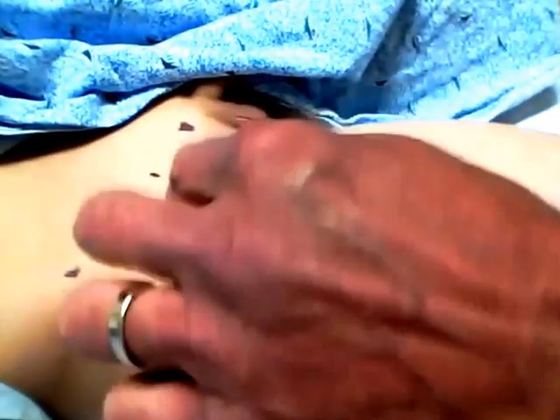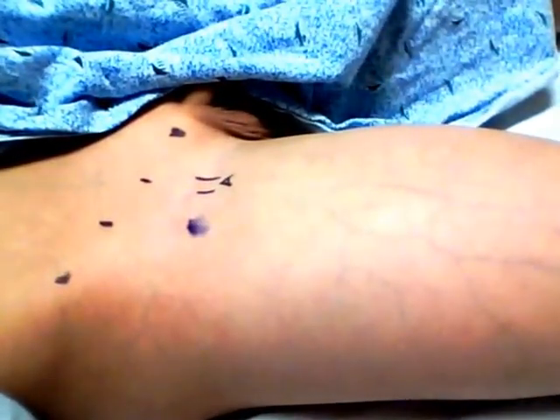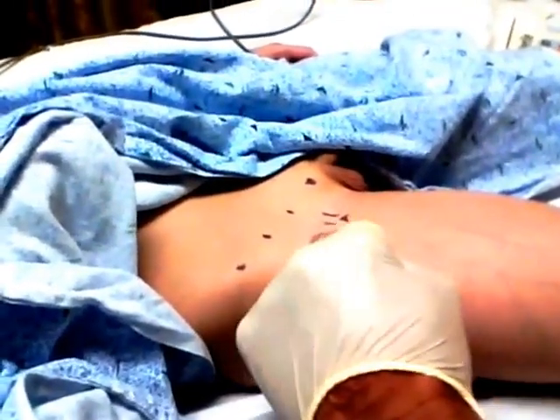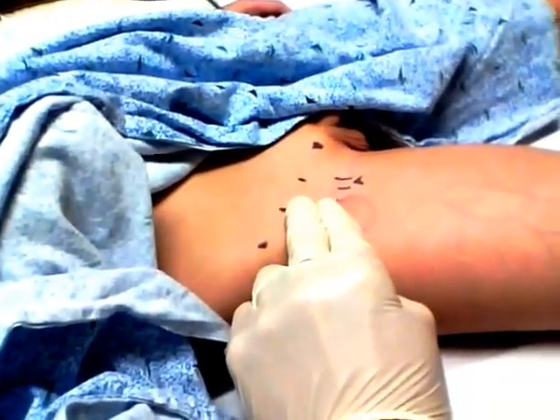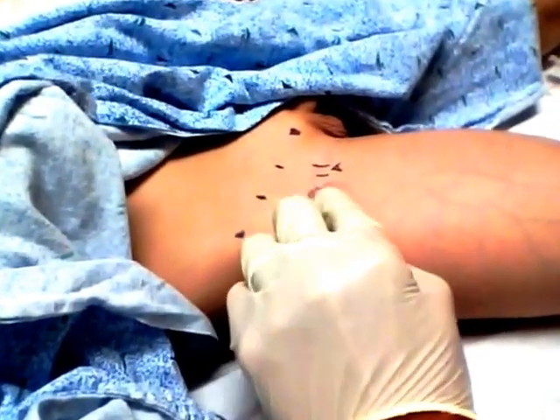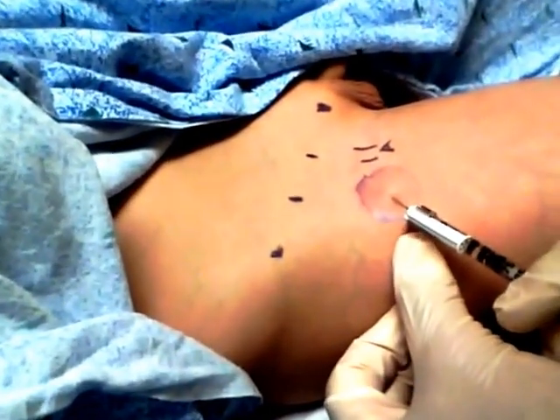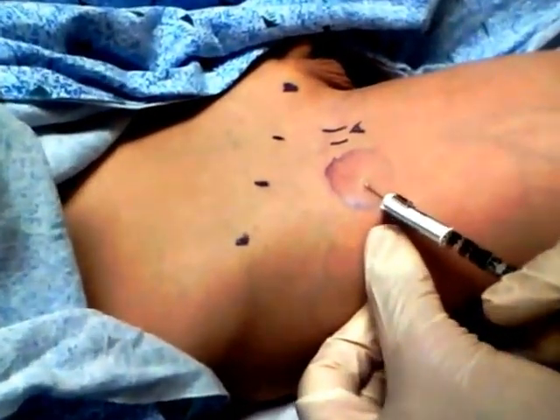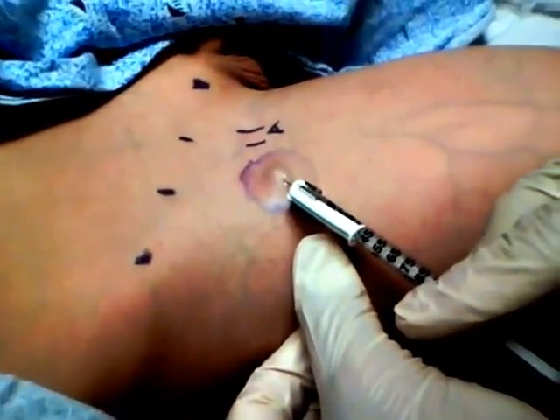I'm going to prep this area again and put a little bit of lidocaine right in the skin to mark exactly where we're going to go. We're going to numb the skin and then raise a little wheal and we'll go from there. We've smeared our dot a bit from cleaning the area with the chloroprep, so I'm going to go about two finger breadths down, right in about here. First I'll raise a little wheal for this patient.